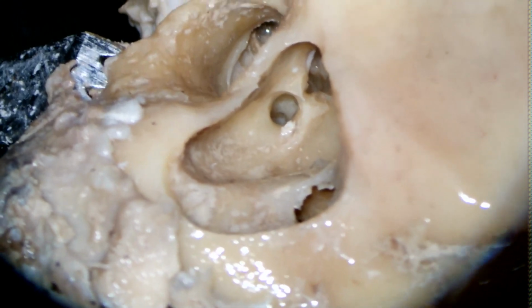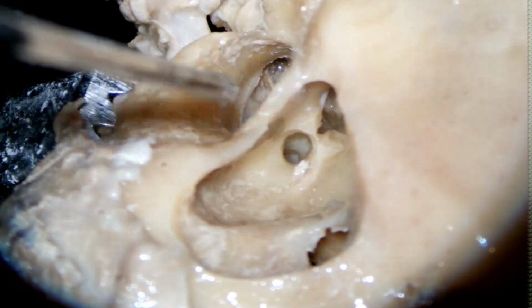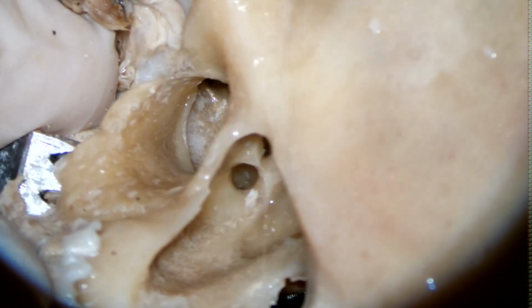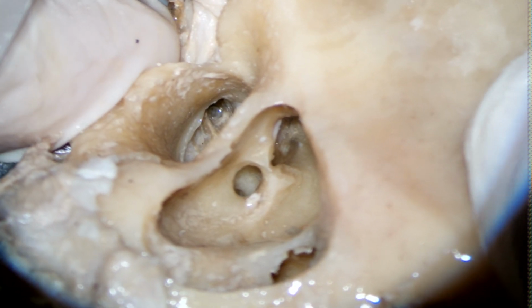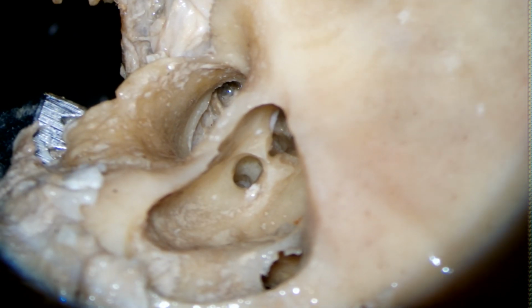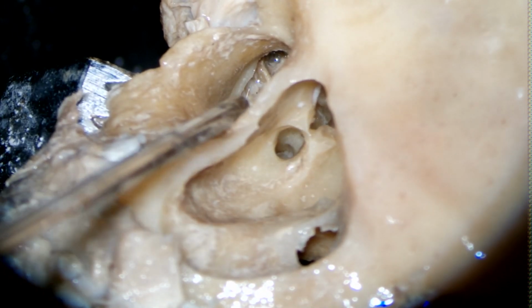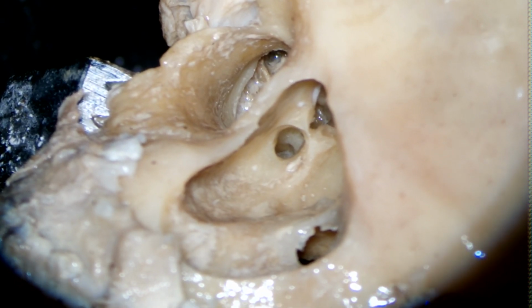Right, I think you can see the, is it a round window? Let me confirm. Or it's a hypotympanic cell. Use the small fine suction.